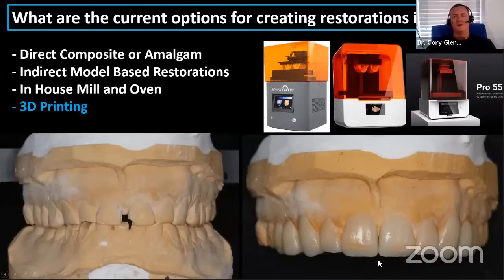What you're seeing down there is actually some no-prep veneers that I had designed in Blue Sky Plan and then exported and printed. So this was purely a wear case. And so this guy, if I had a preoperative intraoral scan on him, we could design these, create the final restorations before he even comes back for a second appointment. And in one appointment could essentially do a full mouth rehab on him.